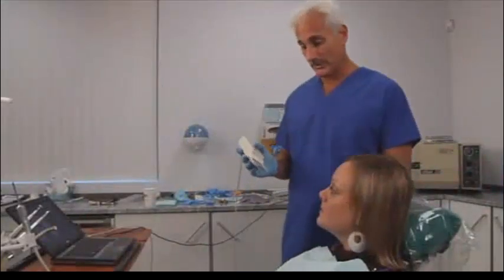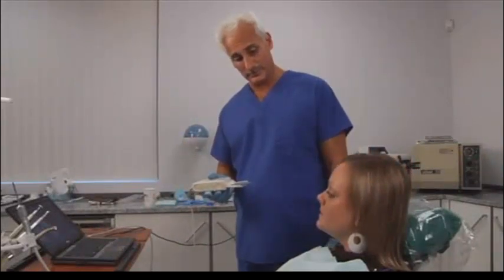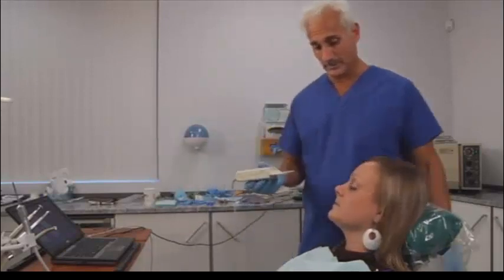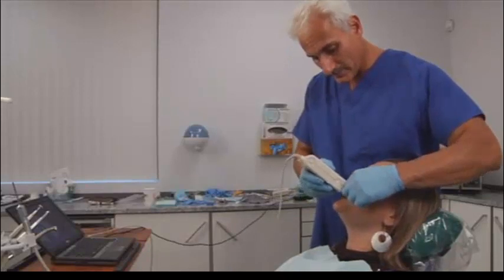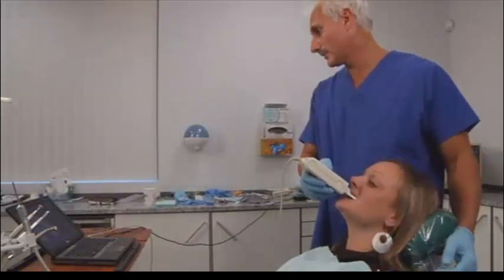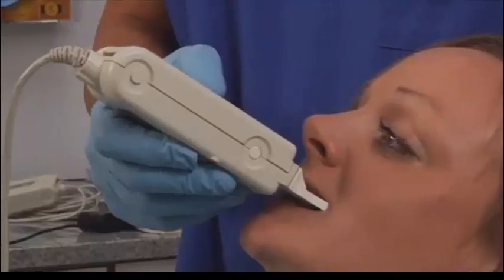So we made those subtle corrections, so I want to remeasure and make sure we improve the situation slightly. So I'm going to have you bite down and slide to the right again. So bite down once for me. Good, open. Bite down again, firmly. Now go to the right.